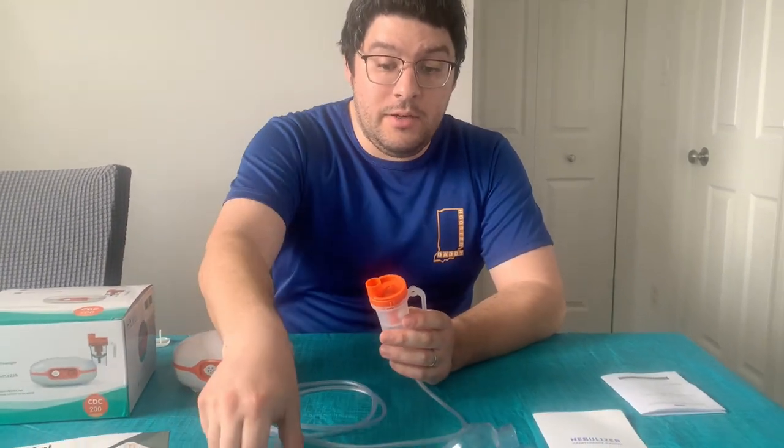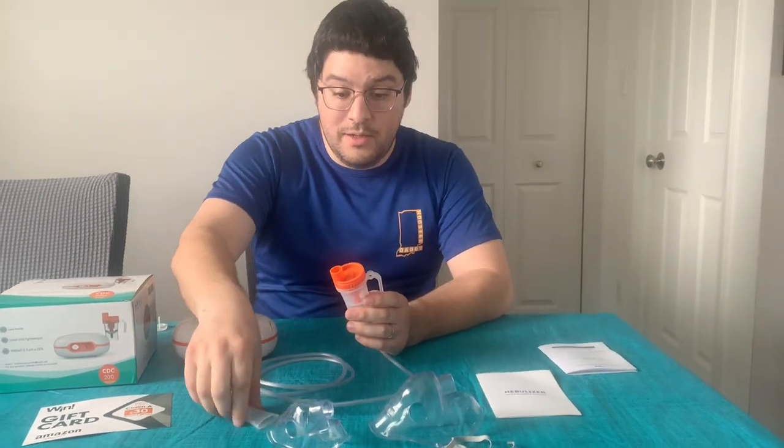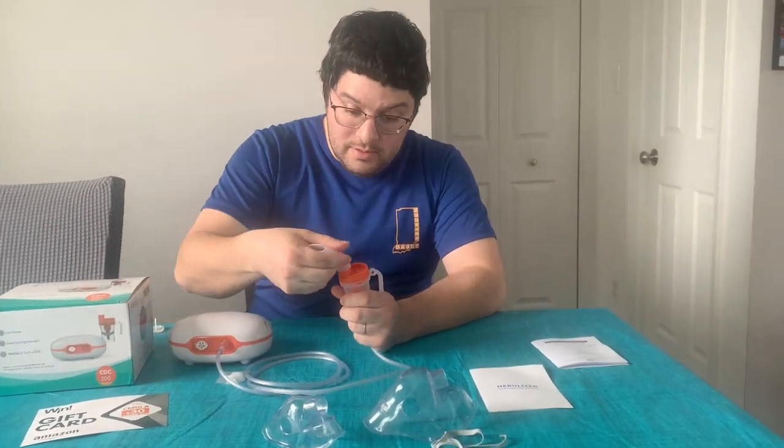At this point, you would choose what kind of delivery method you want for the nebulization. Either you have your mouthpiece or your mask. For this demonstration, I'm going to use the mouthpiece here. Put that on.